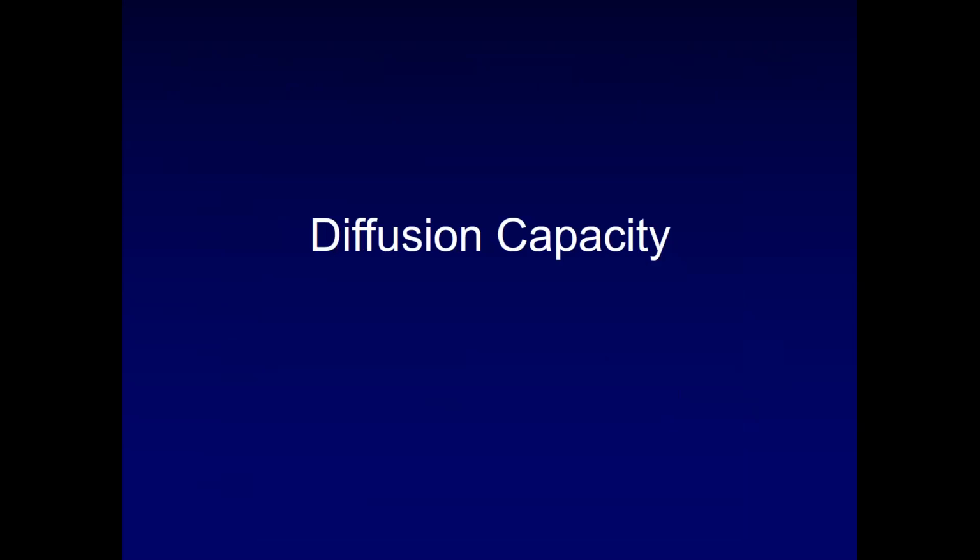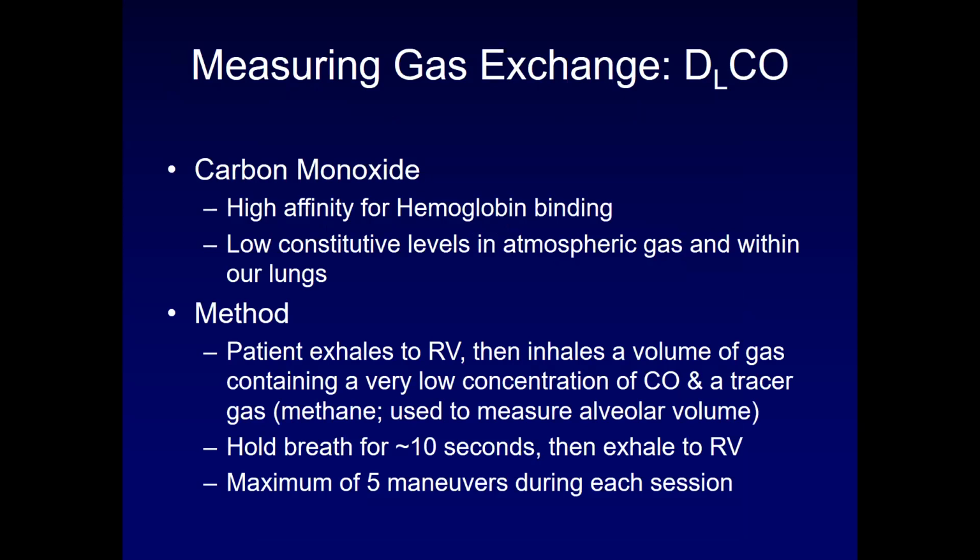Okay, diffusion capacity. I'm going to spend a little bit of time going through diffusion capacity because this is actually pretty important, and because we use this measurement a ton in our clinic, and we should know what the pitfalls of it are. So diffusion capacity is a measurement of gas exchange.